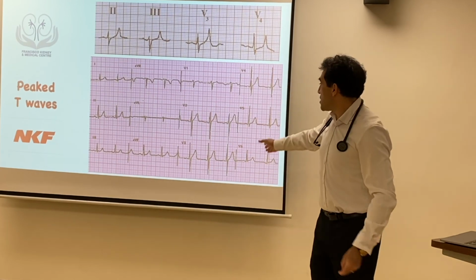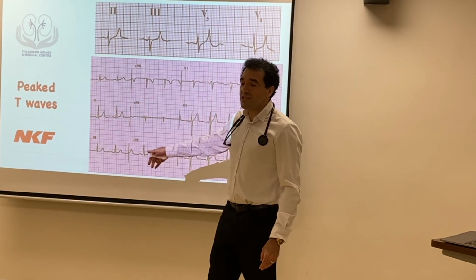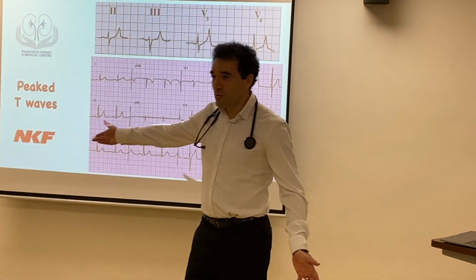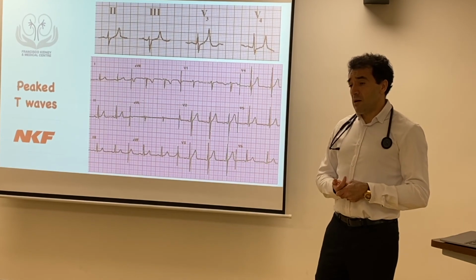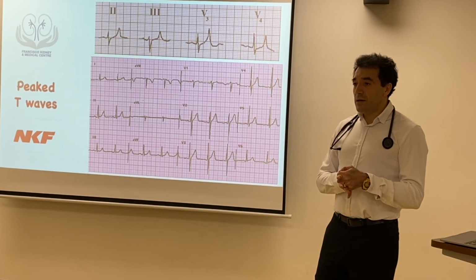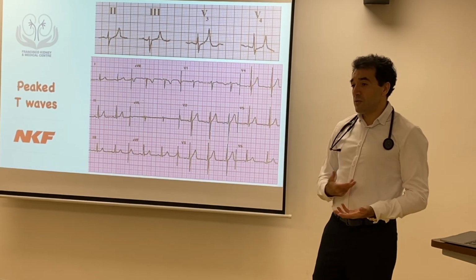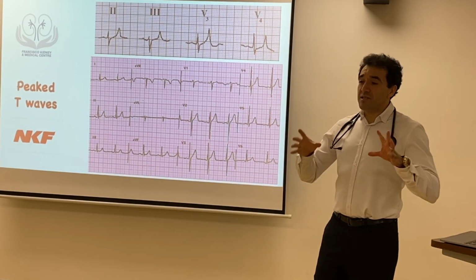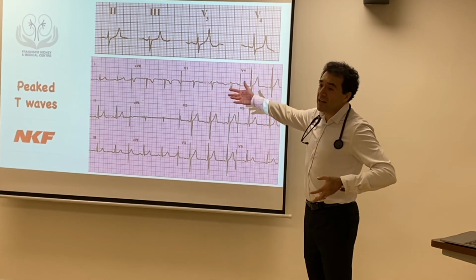Also, the rhythm is not something the patient stays in for just one minute. How long does it take to do an ECG? Probably a couple of minutes to sometimes 15 minutes to do the whole thing. So maybe the situation has already changed. You need to take all those things into account, but it might be that the reading from the blood pressure machine is not so accurate. I'm not sure what the accuracy of that machine is, but I would trust the ECG more because the ECG shows you electrical activity.